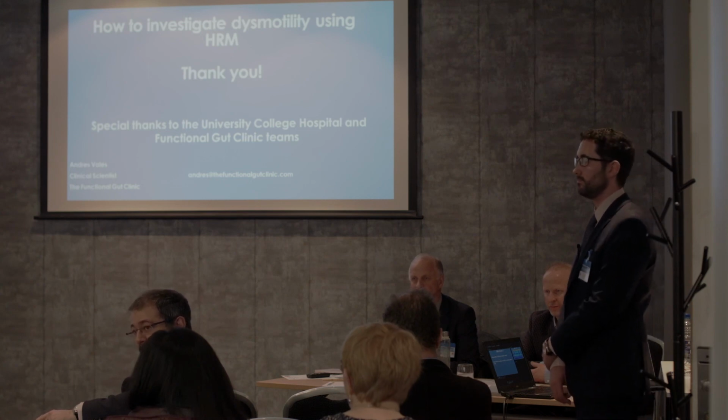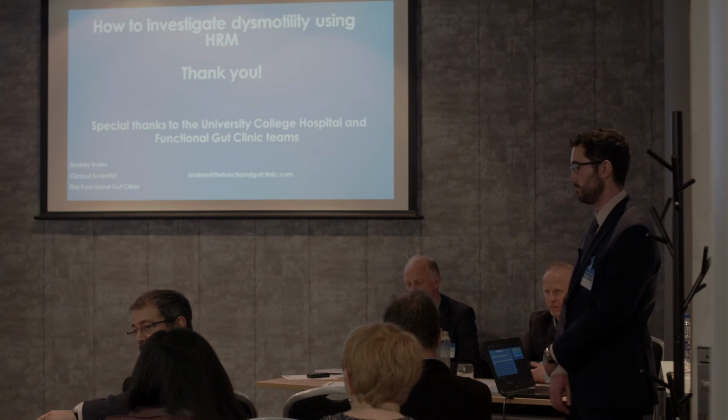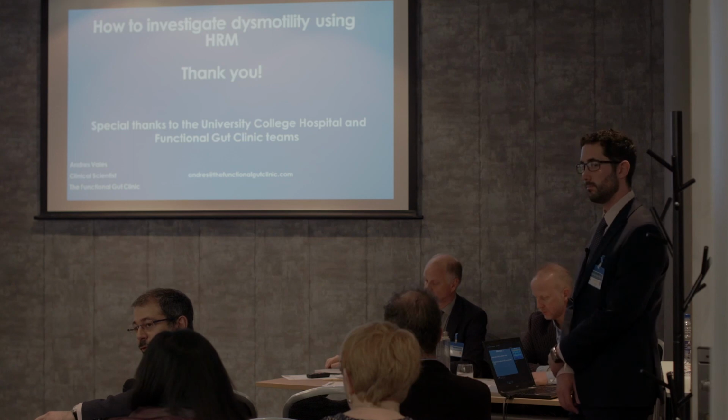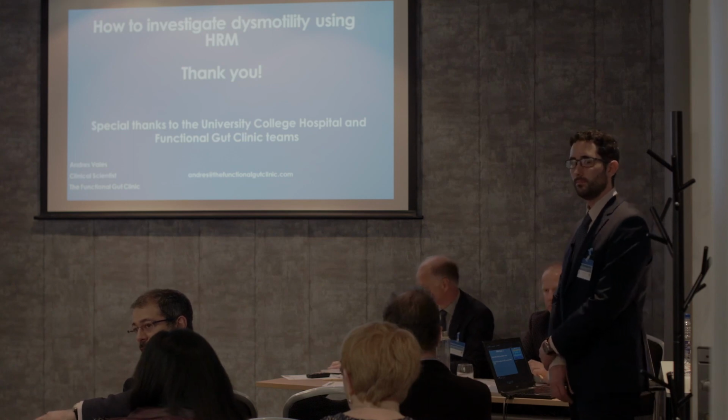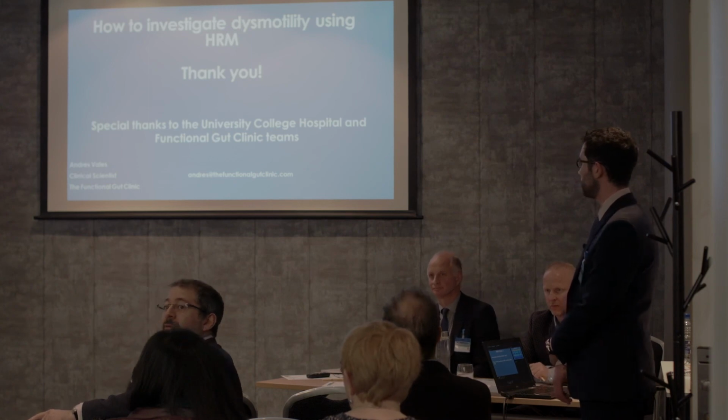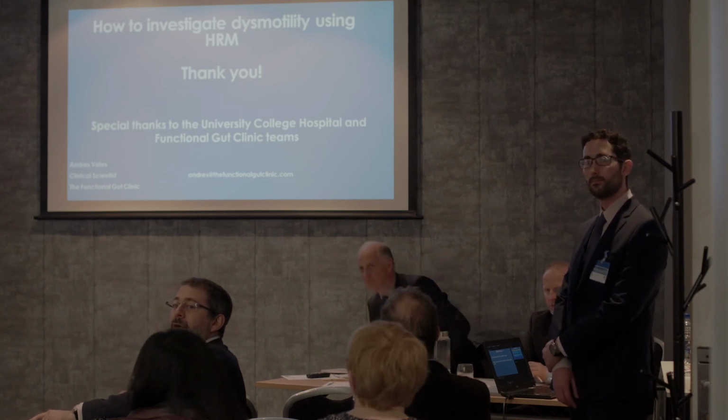But if you've got a small hernia, with less than 3, then you place the gastric marker outside of the hernia. But usually 3 centimeters is the default, distal to the distal end of the intrinsic lower esophageal sphincter, unless otherwise.